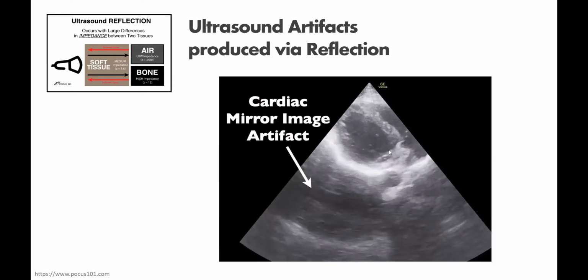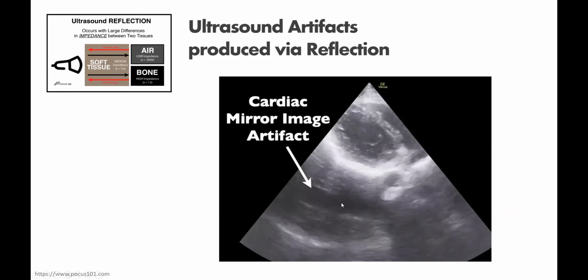Another example is the cardiac mirror image artifact, which can be seen in the lung. See? Okay.